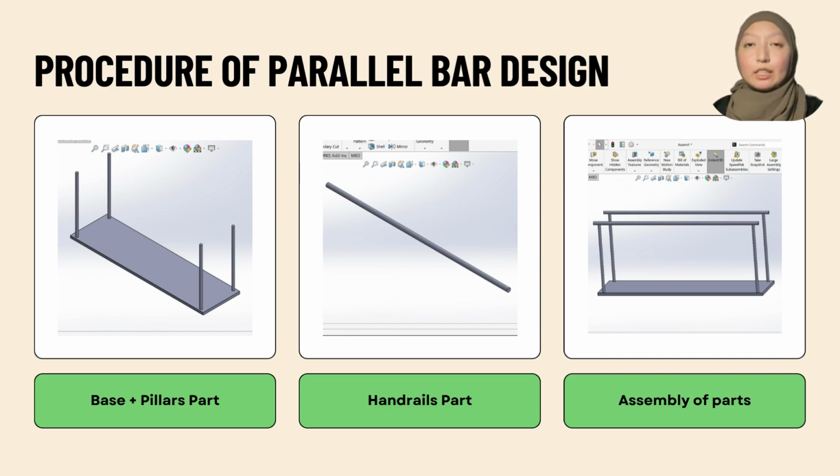In the first stage, a rectangular base with dimensions of 3010 mm as length, 830 mm as width, and 50 mm as height was modeled. 4 cylindrical pillars were then extruded near the corners of the base. Each pillar has a diameter of 50 mm and a height of 1250 mm, serving as vertical supports for the handrails. The second stage involved the modeling of the handrails.